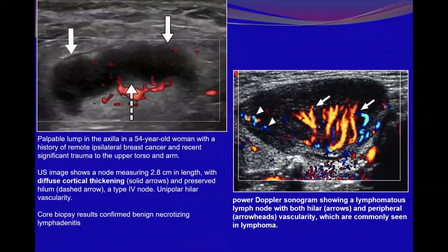But here from the beginning, crowded at the hilum, I can see numerous vessels, though it appears like the native vessels, but there are too many feeding vessels at the hilum, and these feeding vessels then branch. I think this is also abnormal. These are abnormal in terms of the number, not in the appearance of the vessel itself. If you look at the vessels, they seem to be more regular. But as you mentioned, you don't know where the entrance is from here. The crowding of branches at the hilum suggests that all these are abnormal vessels rather than just branches. And this can be supported by the presence of the abnormal smaller peripheral vasculature. I see. Non-hilar is abnormal.